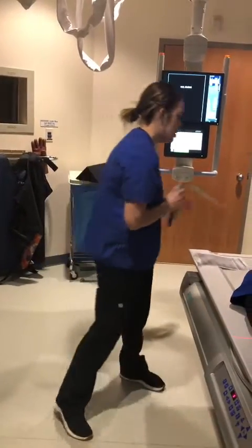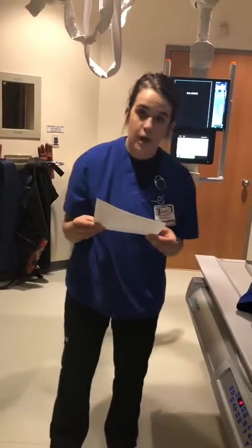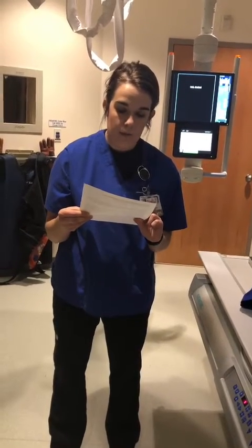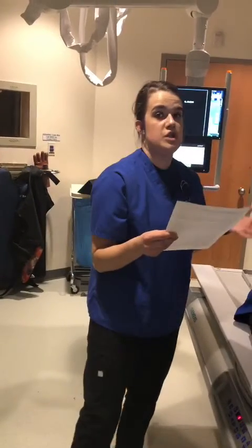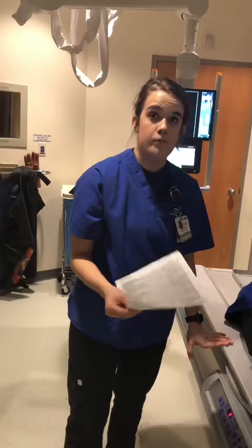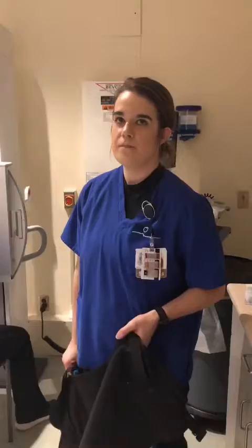So I'm going to look at my chart here, and for 24 centimeters I would set an 87 kVp, a mAs of 24. Again, I would have a 40-inch SID, and this is a table Bucky exam. And that is how you do an AP supine abdomen.